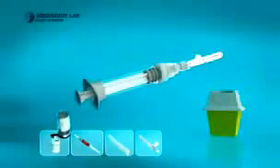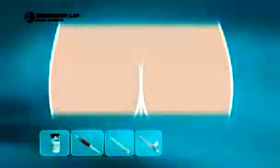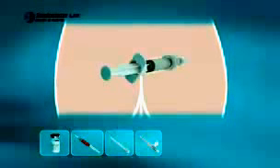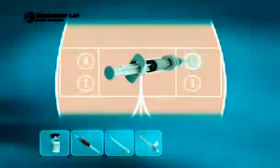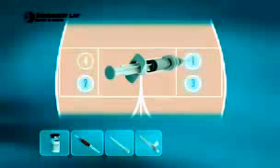Immediately properly dispose of all packaging and devices used for the preparation and administration of the drug product into an approved sharps container. Again, Sandostatin LAR must be given only by deep intragluteal injection, never intravenously. Sandostatin LAR is injected once every 4 weeks. The site of repeat intragluteal injection should be alternated between the left and right gluteal muscle every 4 weeks. Do not use the same gluteal region each time.